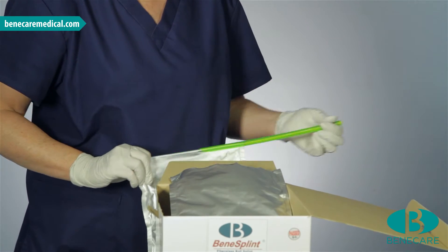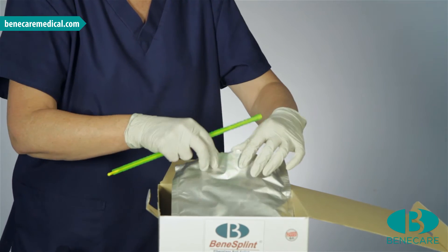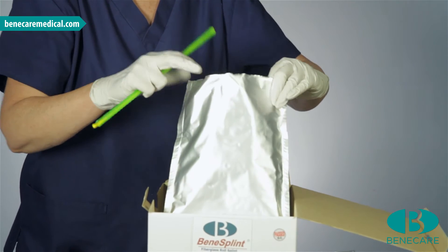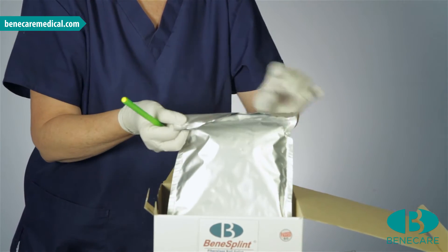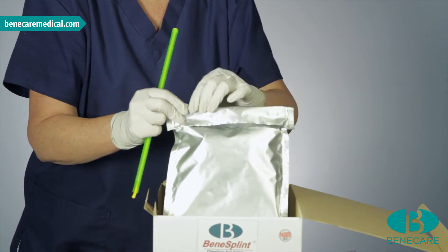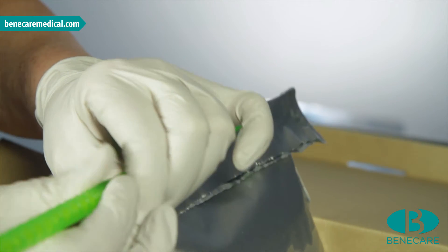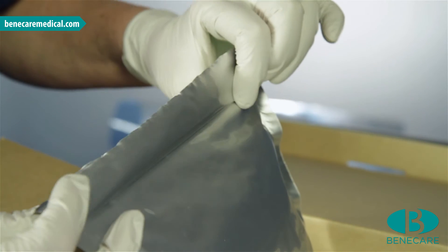Remove the clip from the end of the foil and put the splint to one side. I will now seal the pouch. This is very important as it will prevent the splint from setting within the pouch. Fold the splint over and then make a crease in the foil. Now take the plastic clip and slide along the crease. Ensure this is secure and airtight.